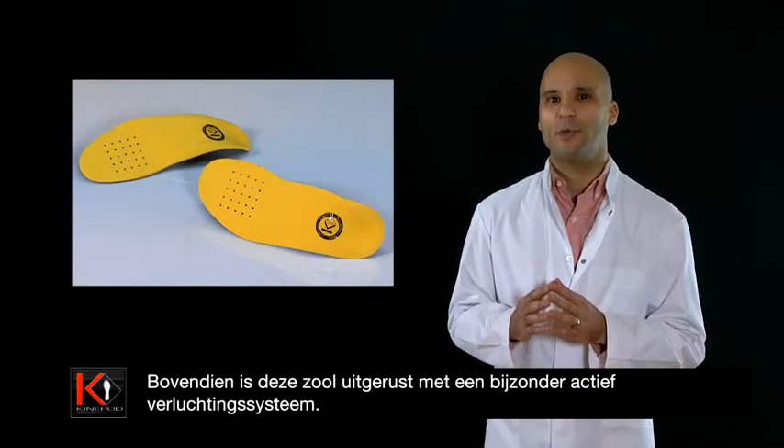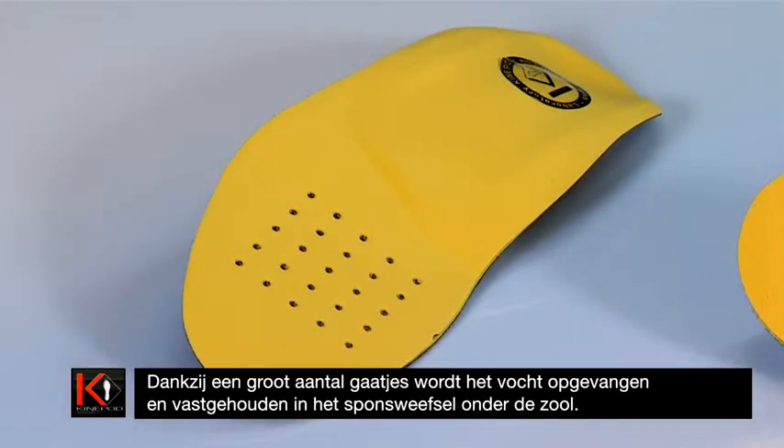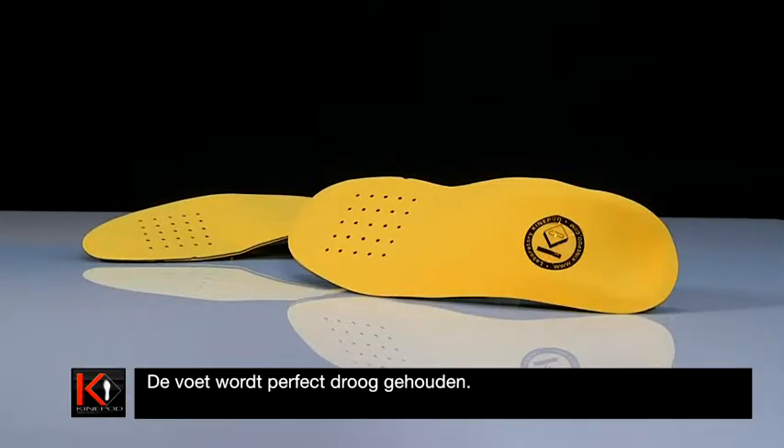In addition, the sole incorporates a particularly active ventilation system. A large number of holes allow moisture to be absorbed into the sponge material on the underside of the sole, keeping the foot perfectly dry.